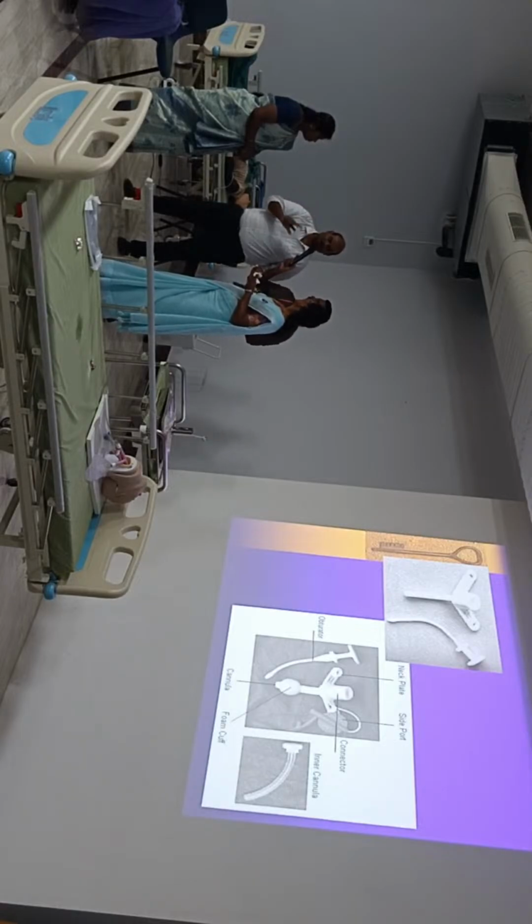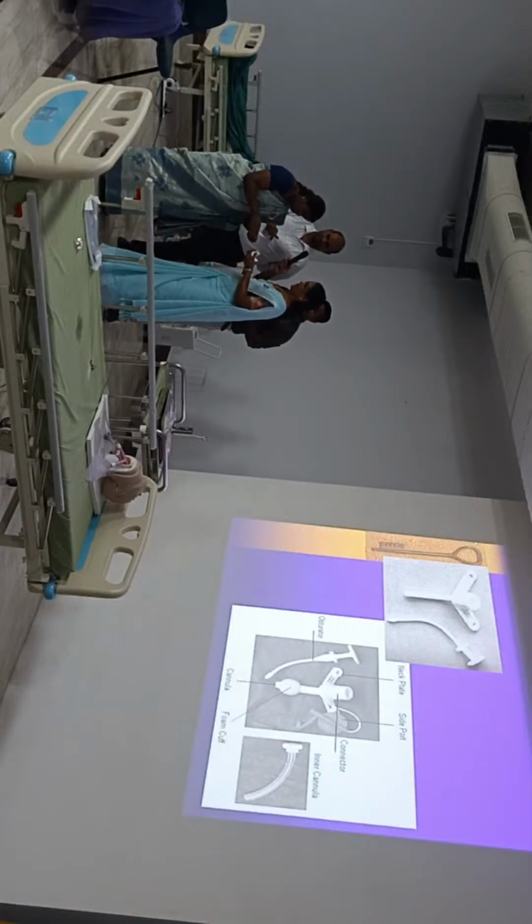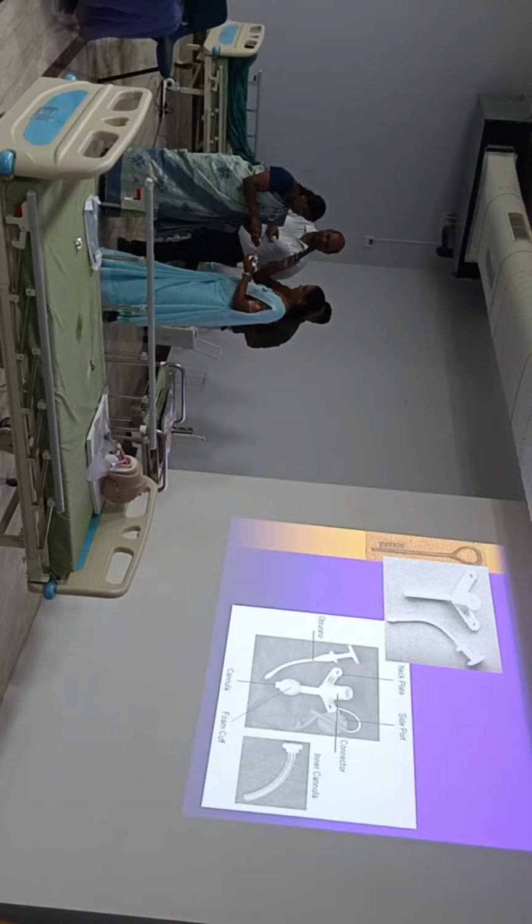So there is no hard and fast rule. You have to inflate with 5 to 10, basically entirely clinically customized. Just inflate the balloon. Inflate with 10 ml. There's no patient here. No, inflate with 10 ml. That's what I'm trying to say. You just feel the pressure.